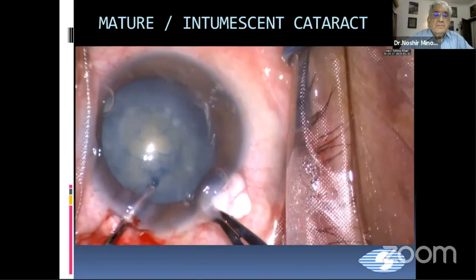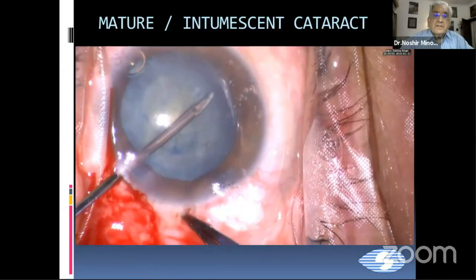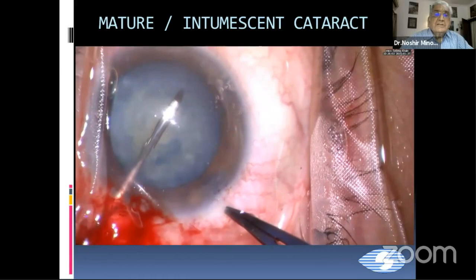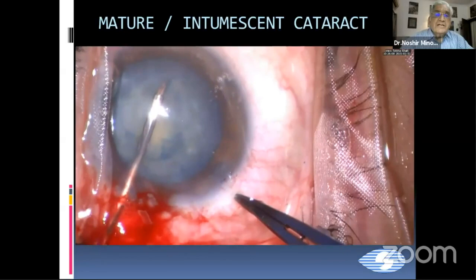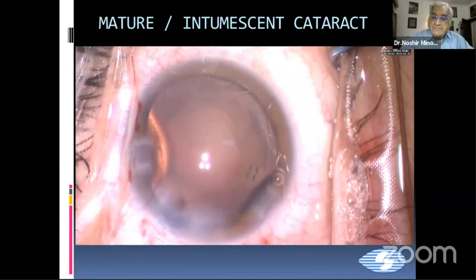We do that on the other side also—make a nick on the other side of the capsulorhexis margin and again extend it so that we have a larger capsulorhexis and can do phaco emulsification very easily. And this is the capsulorhexis we have got finally.